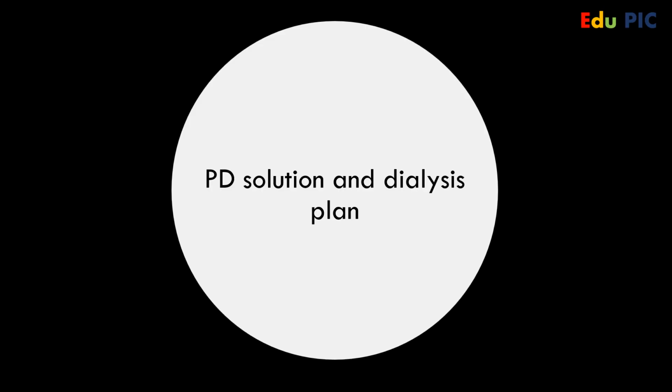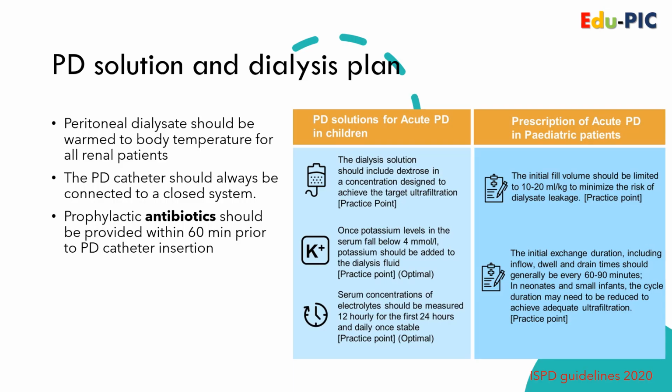Okay, so you've put the PD catheter in. Now you need to know what you are doing with your solution, what your dialysis plan is, and how you control it. Okay, let's start with the simple stuff.